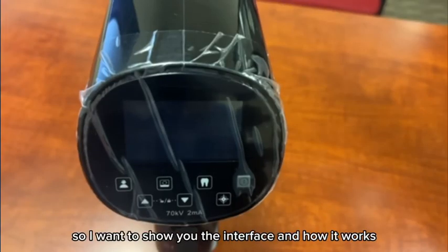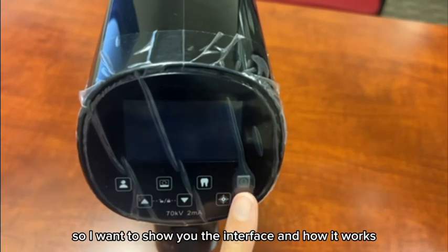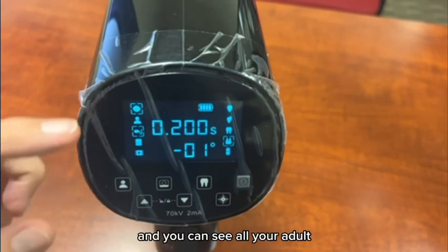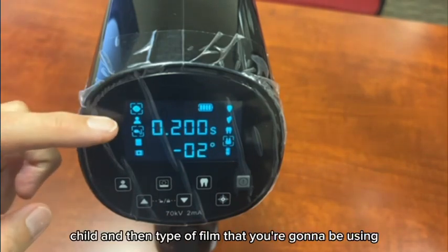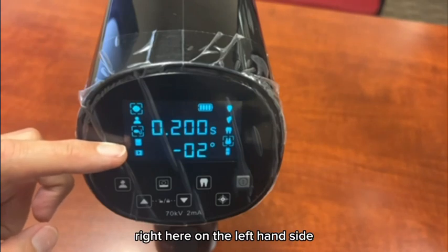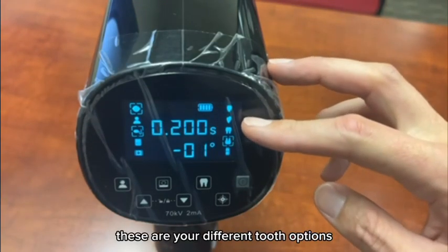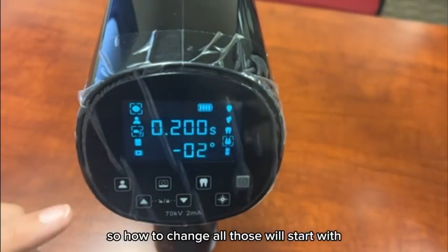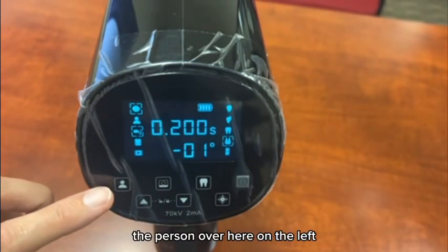Okay, so I wanted to show you the interface and how it works. Here's the power button, and you can see all your adult, child, and type of film options right here on the left-hand side. On the right-hand side, these are your different tooth options for your exposure. To change all those, we'll start with the person icon over here on the left.